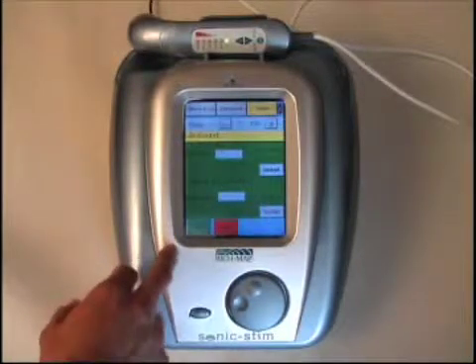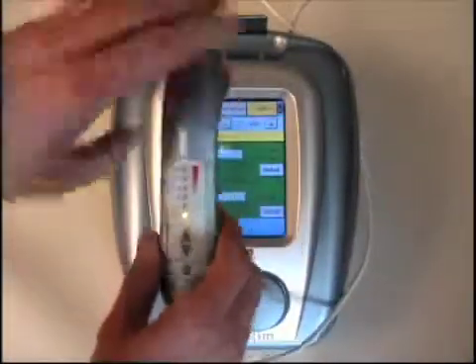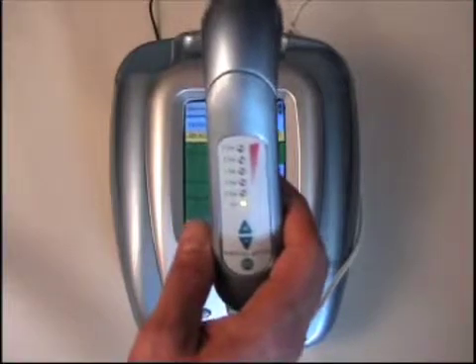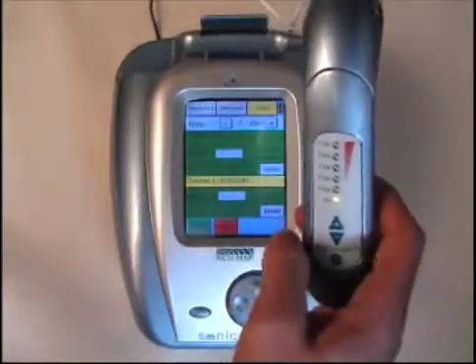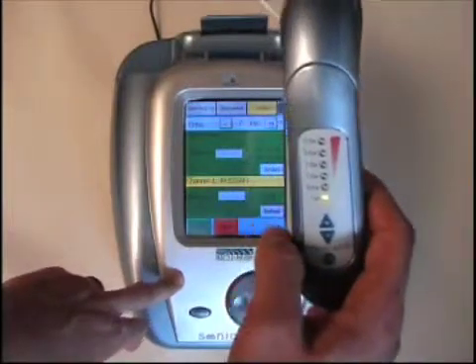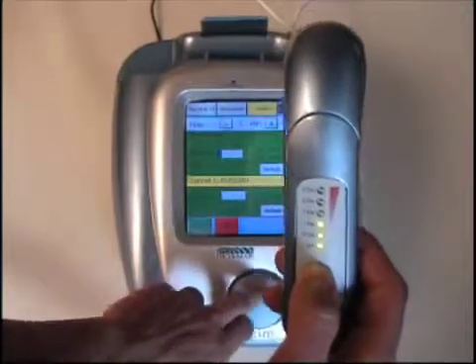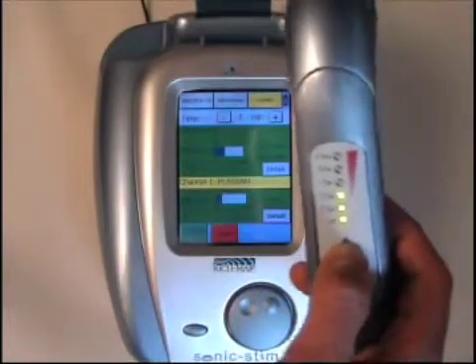The Sonic Stim has a very unique feature that many people like: the applicator controls can be adjusted at the same time as the stim side is being adjusted in combo mode. After selecting channel one on the stim section of the screen, the stim intensity can be adjusted at the same time the ultrasound output is adjusted on the applicator. This is a unique feature that no one else in the industry offers within these units.